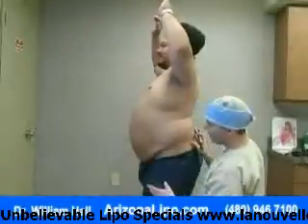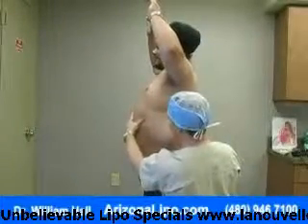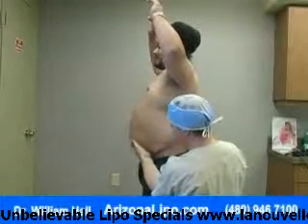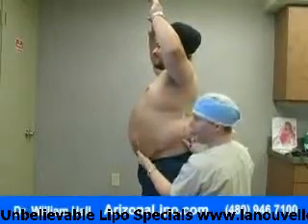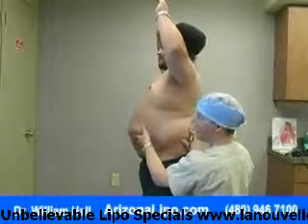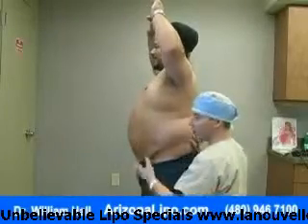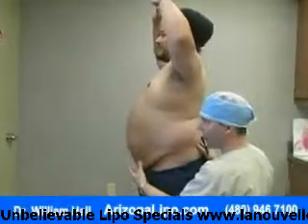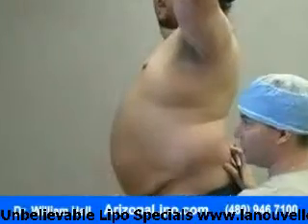Okay, so a lot of this fat that you have up in here, we really can't do anything about that because that's all the fat that's inside your belly. We can't squeeze very much. When we talked about this part right here, which we call the pannus, we're going to completely remove this with lipo. And you won't have hanging skin afterwards. Oh, good. This skin will retract right back up like this, so it'll be fairly tight up against your abdomen when we take the fat off. Oh, good. The only thing that's keeping the skin hanging down is the weight from the fat. Okay. Without the weight, the gravity can't take effect, and hence the skin won't hang.